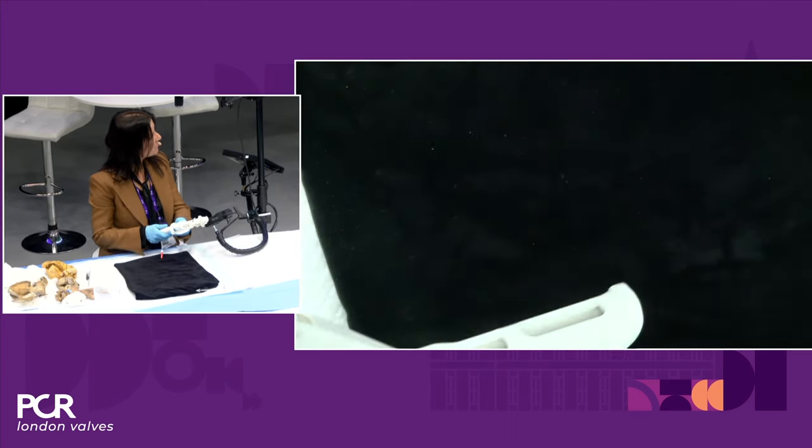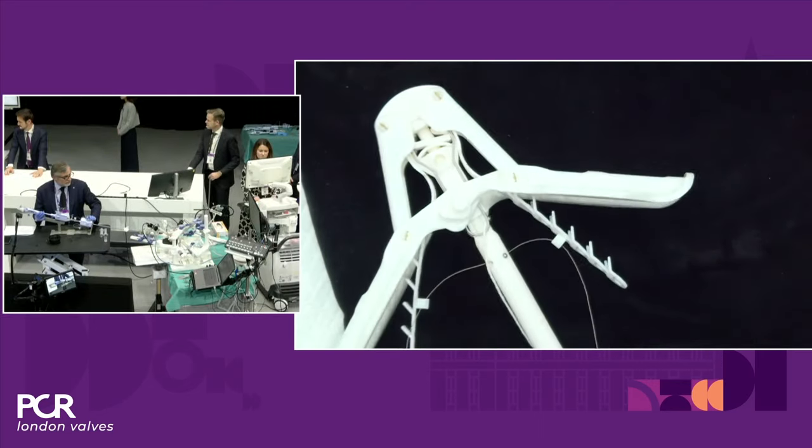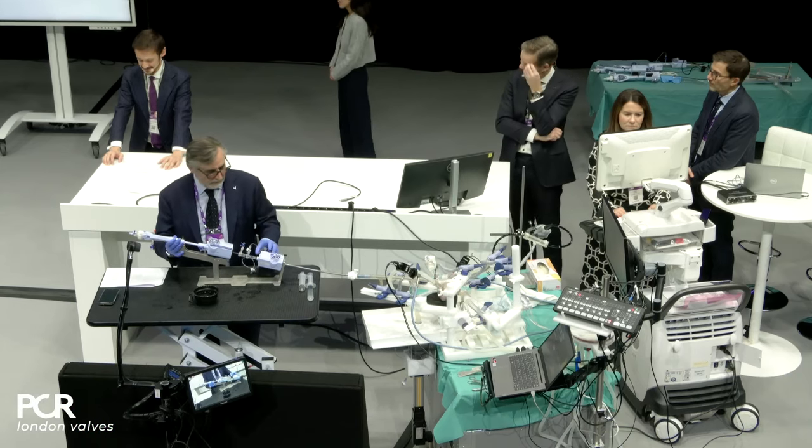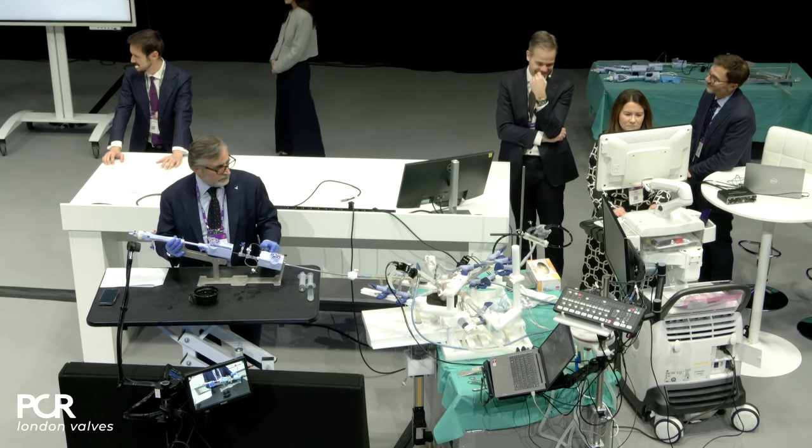Yeah, Anya, so this is a nice marketing proposition. Let's see if this is true. Let's try a gripper on our specimen. Let's see what is the effect.